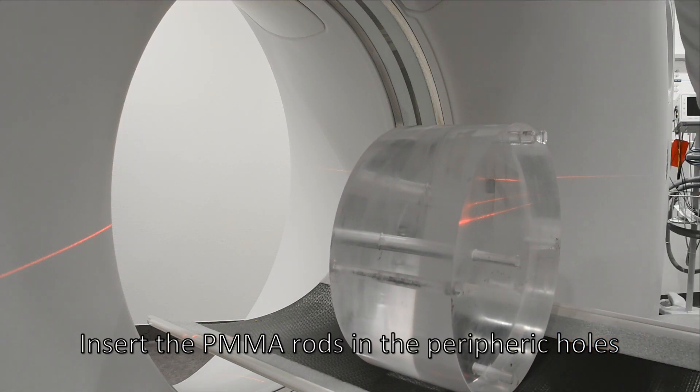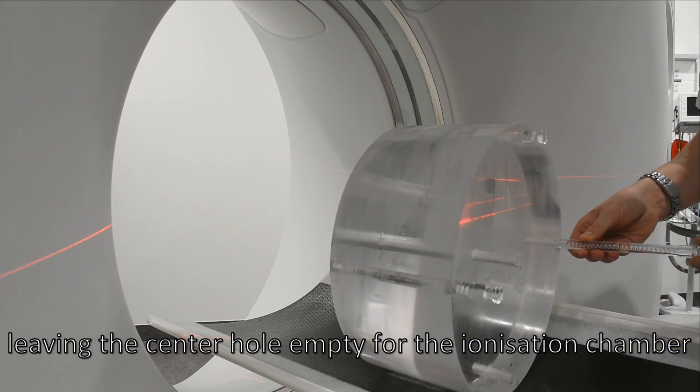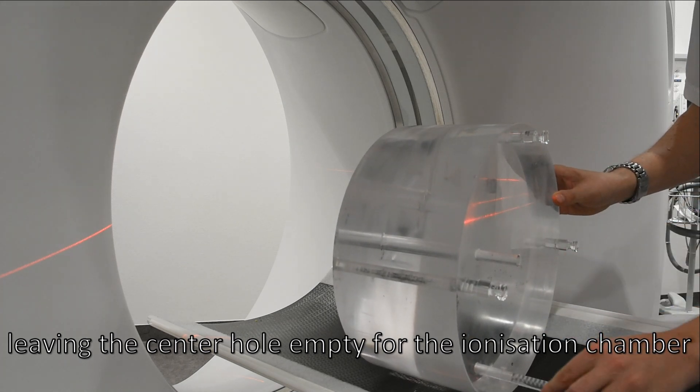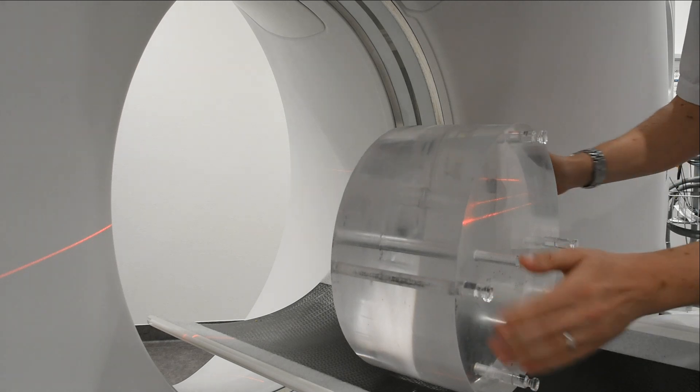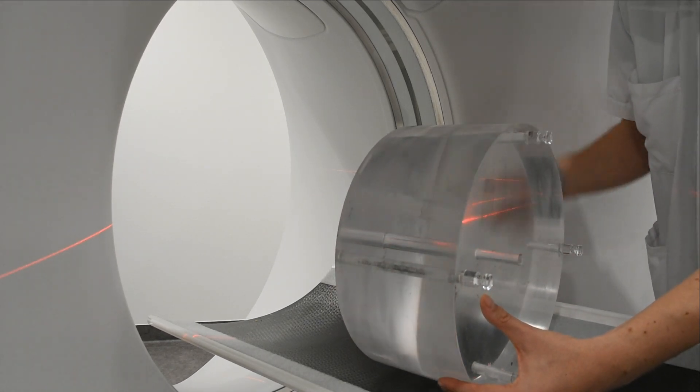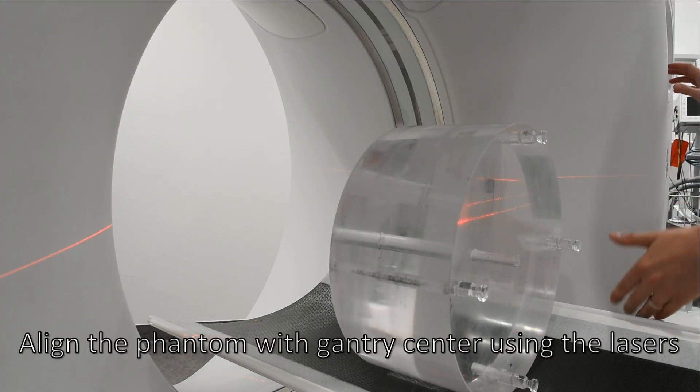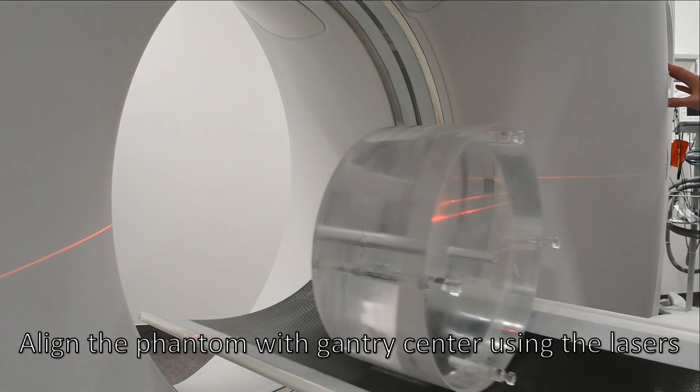Insert the PMMA rods in the periphery holes, leaving the center hole empty for the ionization chamber. Align the phantom with gantry center using the lasers.